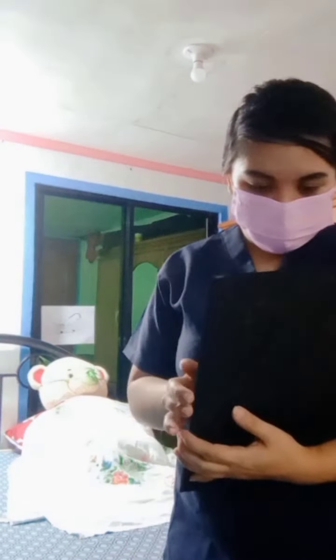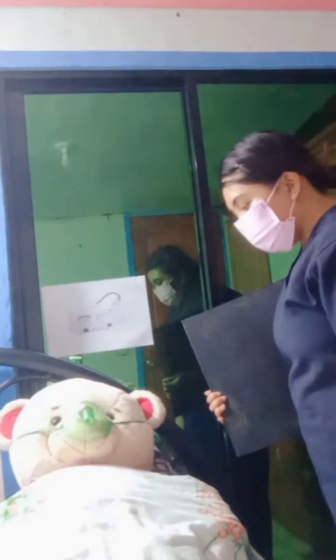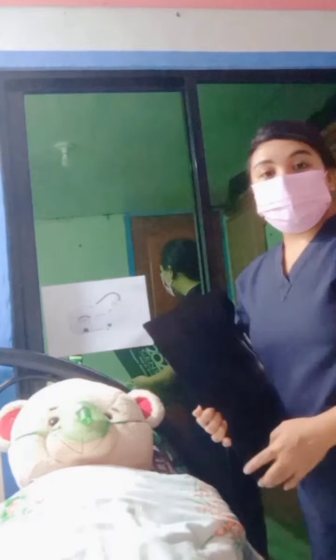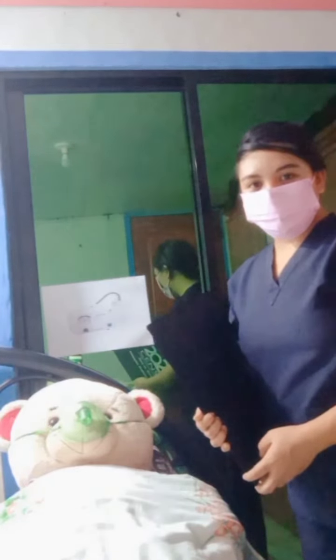So for the procedure, in implementation, first you have to check and verify the doctor's order and then identify the patient. Good day, Mom. I'm Krisha, your caregiver for today. May you state your name and your birthday, Mom? Okay, great. Then, explain the procedure to the patient. Ensure patient's privacy.